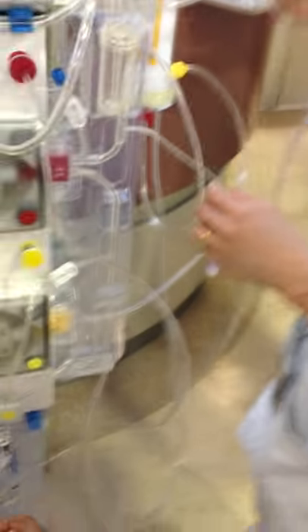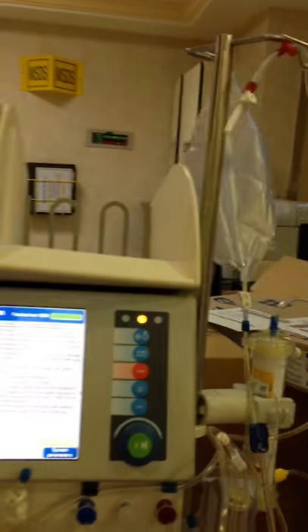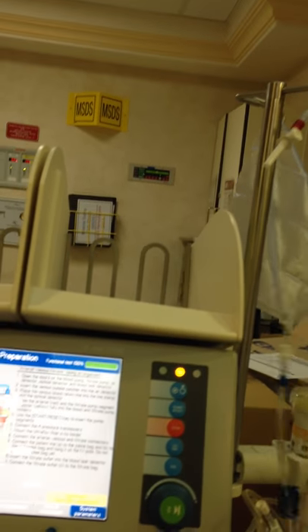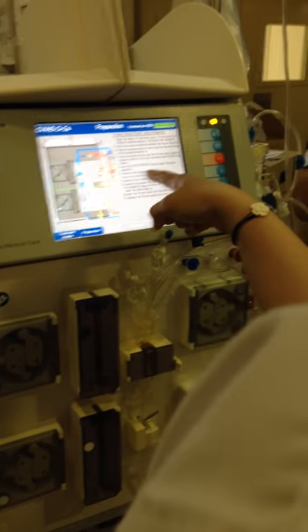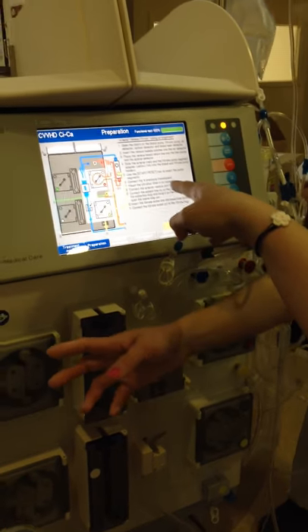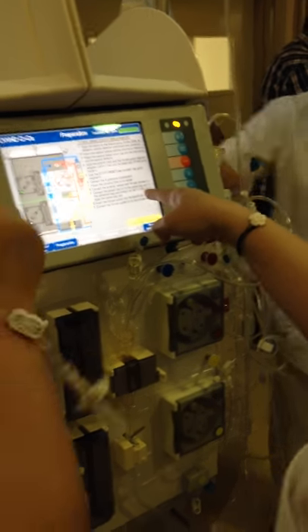Okay. Now, once you have everything in there, let's start from there. One in arterial and one in venous. This spike is from the arterial. Your heparin should be in there, right? This one is from the arterial too. Maybe bring the one here. Okay, what's next now, Marcel?